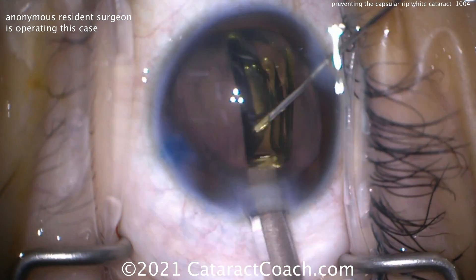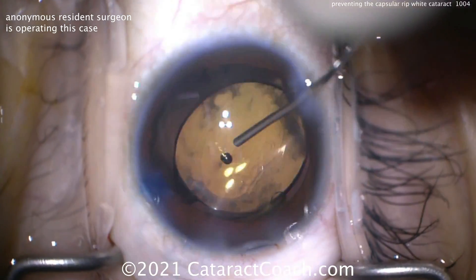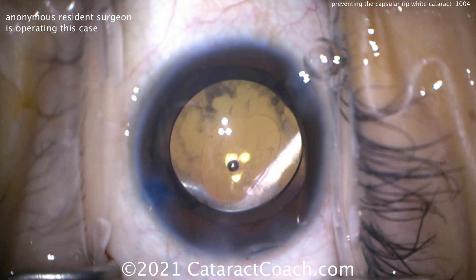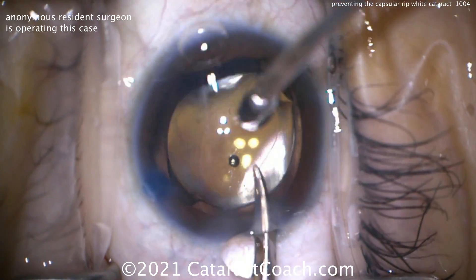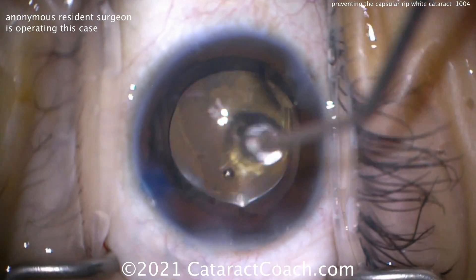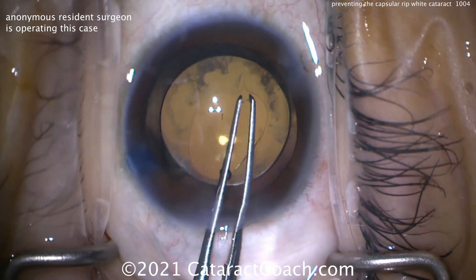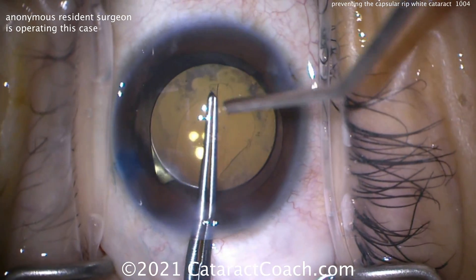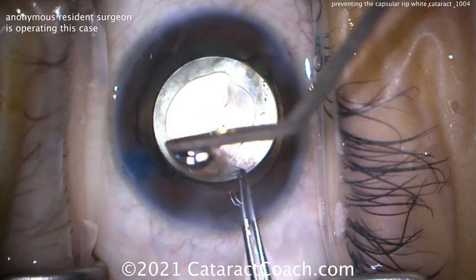So when we get that lens inside the eye, make sure it goes in the capsular bag. Now we can see that the rhexis is irregular and small. You could leave the case just like this and it would be fine — but we can do another step. We can use small scissors to cut a nick in that anterior lens capsule, then use the forceps because the eye is filled with viscoelastic. There's a lot more control with the IOL already in the capsular bag. And look at that — we're going to enlarge that capsular rhexis. This is going to be a beautiful outcome.